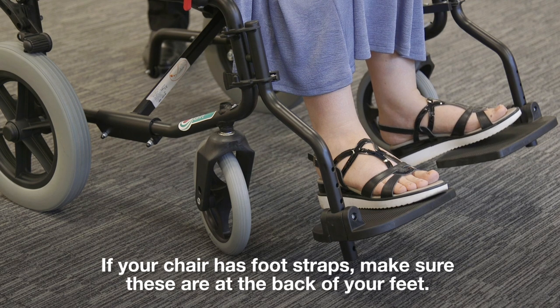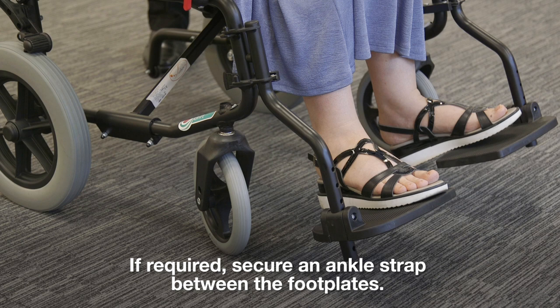If your chair has foot straps, make sure these are at the back of your feet. If required, secure an ankle strap between the footplates.